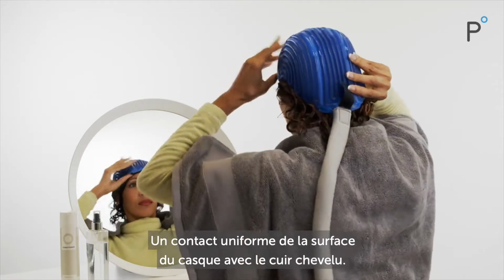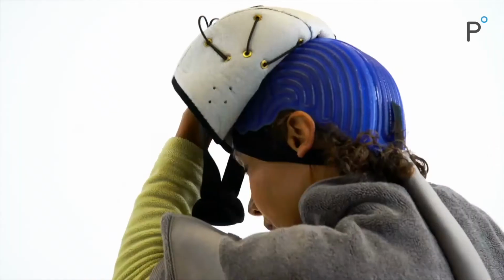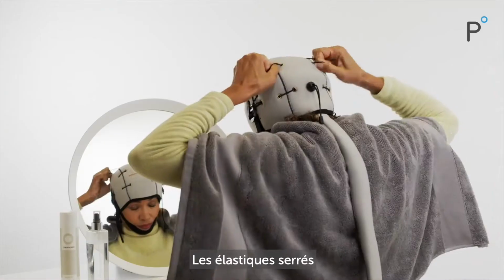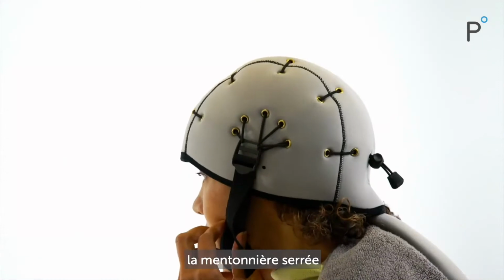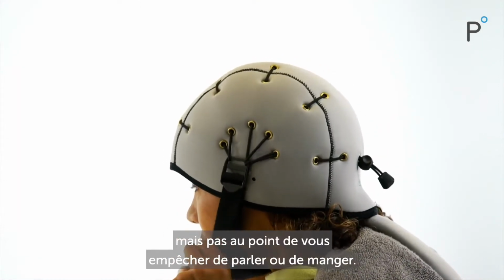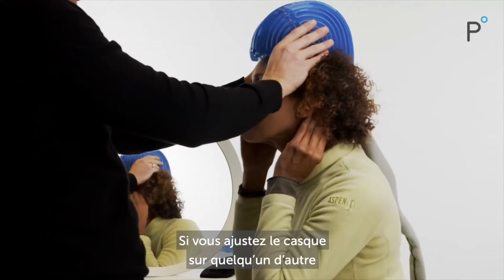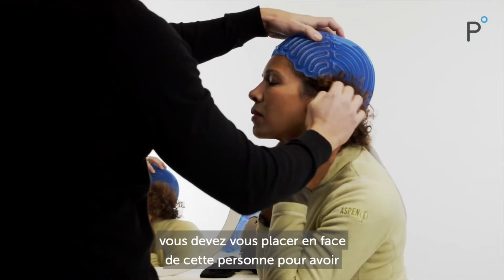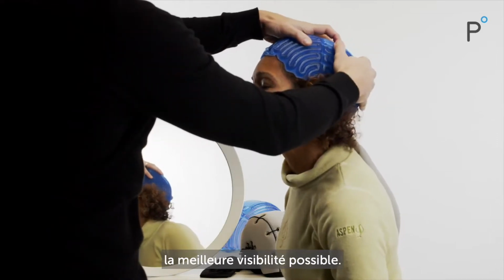Consistent all-over contact of the inner cap with your scalp. The inner cap and cover positioned centrally on your head. The bungee cords tightened. And the chin strap tightened, but not so much that you can't talk or eat. If you are fitting the cap to someone else, it is important that you are standing in front of that person to ensure you get the best visibility.